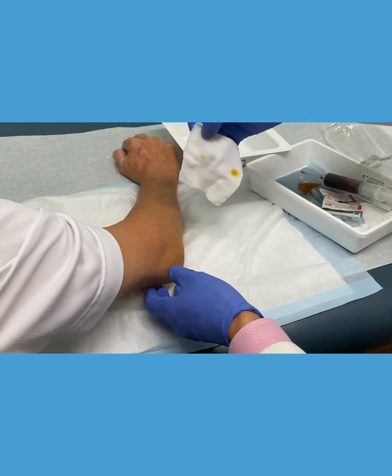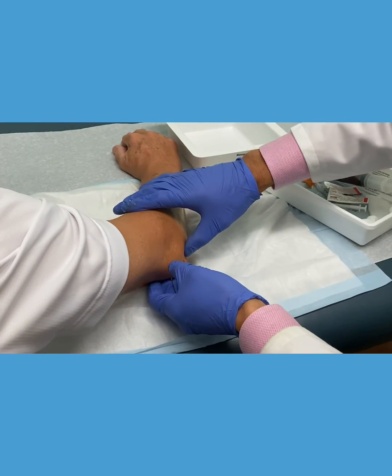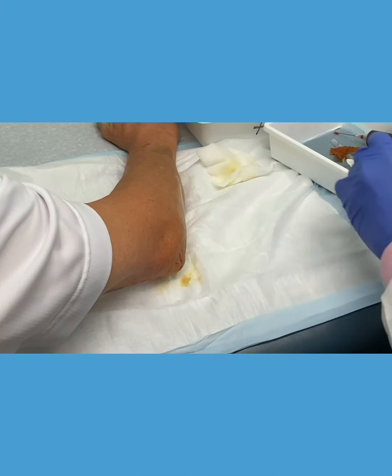I'll just put a little pressure dressing on it — that should take care of it. The important points here are to get an x-ray. This particular case did have a tiny little bone chip. So get an x-ray first, make sure everything's okay, and then aspirate if you need to. That's it. Thank you very much.